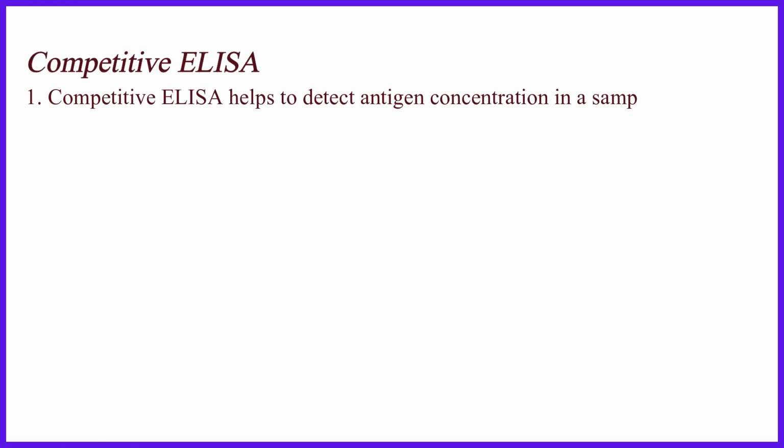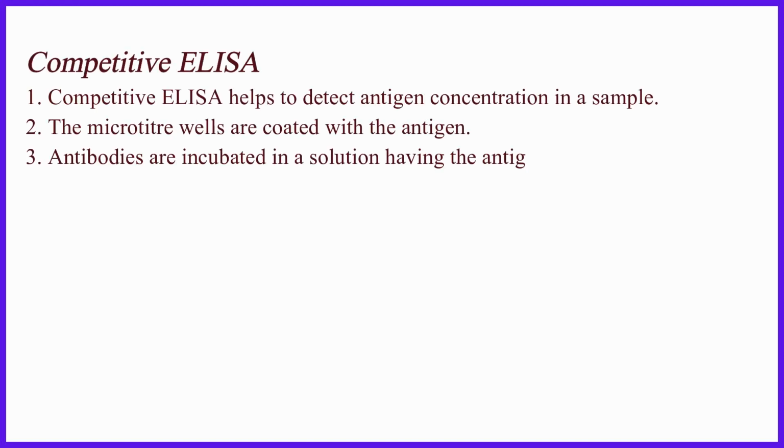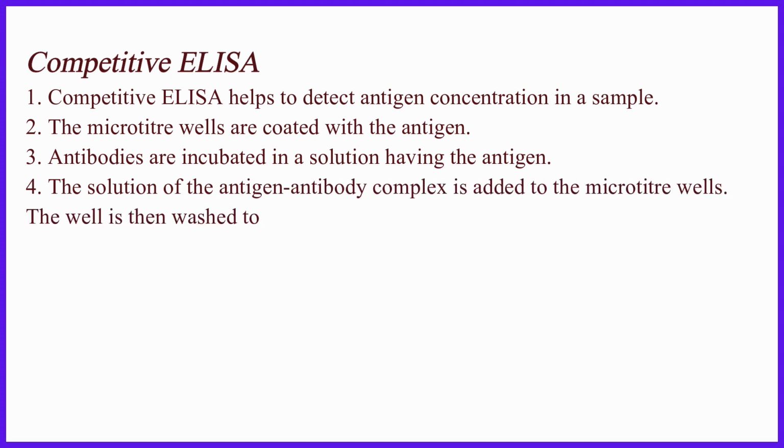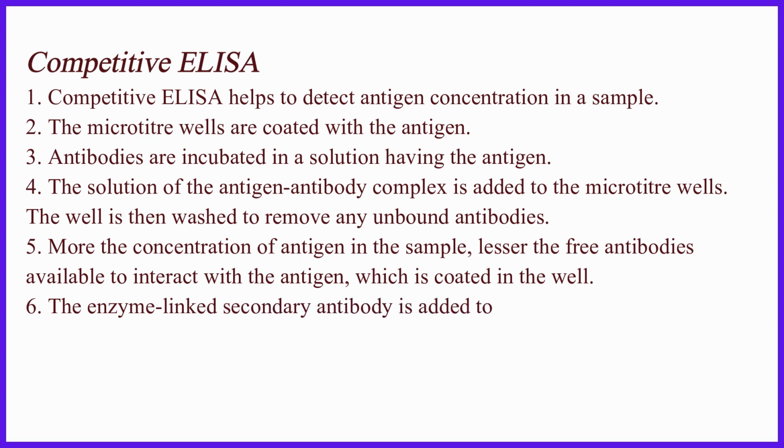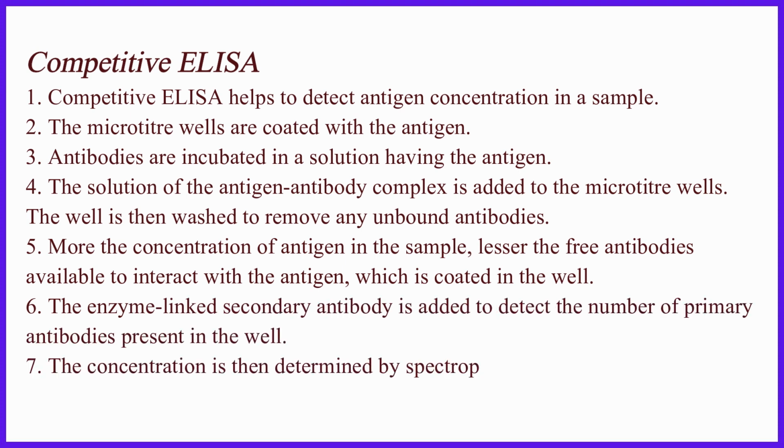Competitive ELISA helps to detect antigen concentration in a sample. The microtiter wells are coated with the antigen. Antibodies are incubated in a solution having the antigen. The solution of the antigen-antibody complex is added to the microtiter wells. The well is then washed to remove any unbound antibodies.